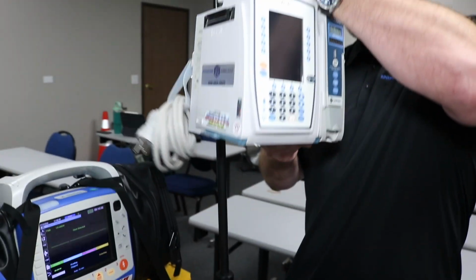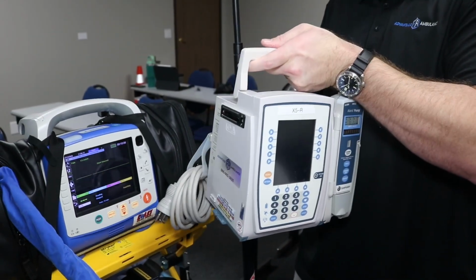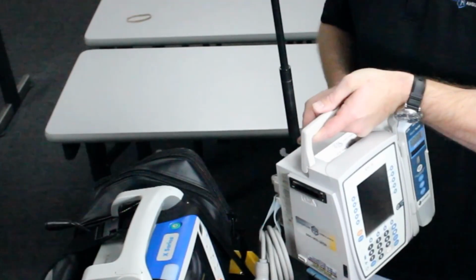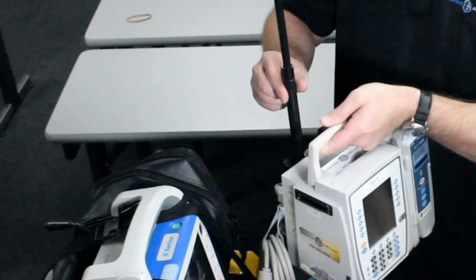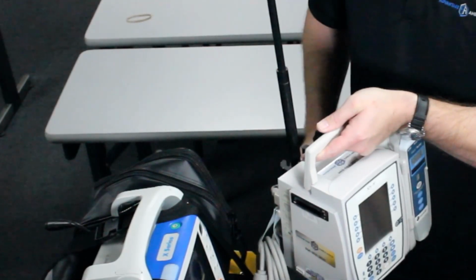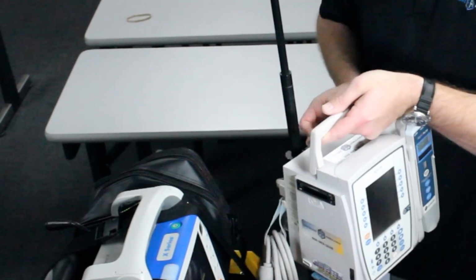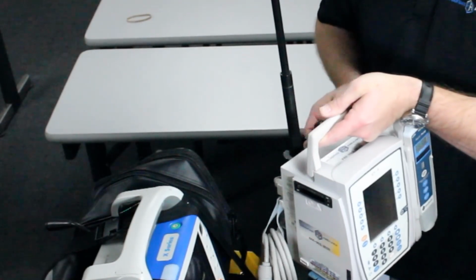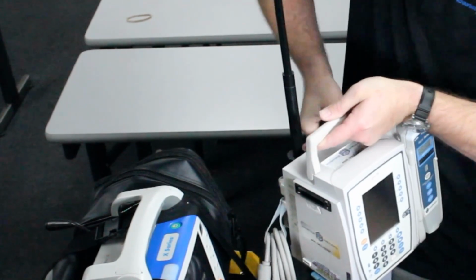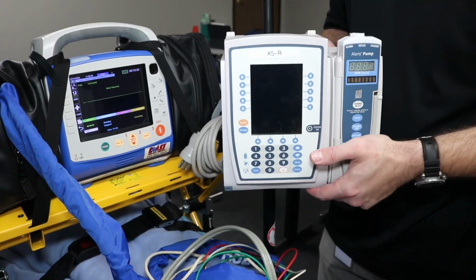I want to make sure that I don't have it up too high or too low. I want to make sure it is where I can access it or the nurse can access it. So I usually like to make sure it's on this middle section, definitely not up on the top section here. So I'm just going to screw this down again, clamp it down so it's nice and secure and tight. Give it a few good turns, just hand tight but nice and firm.